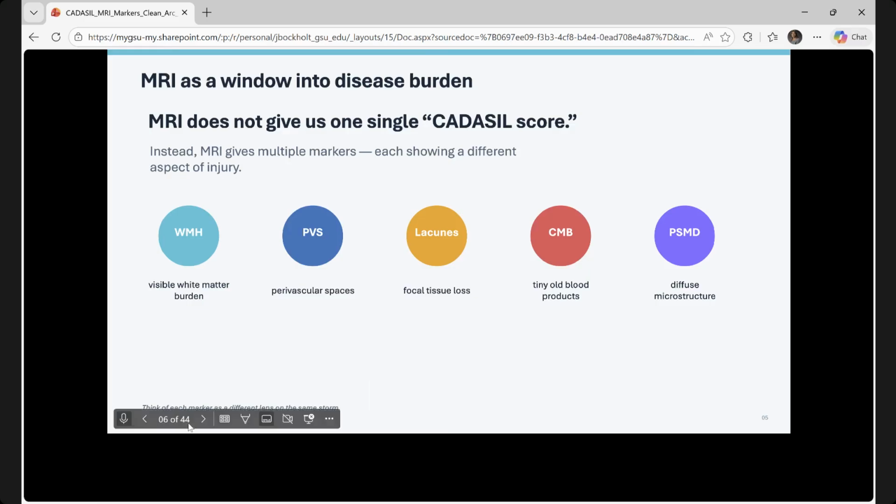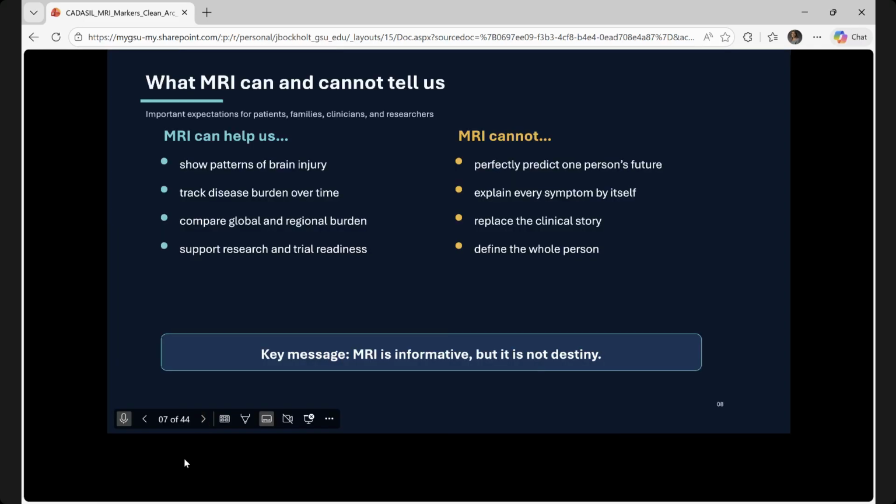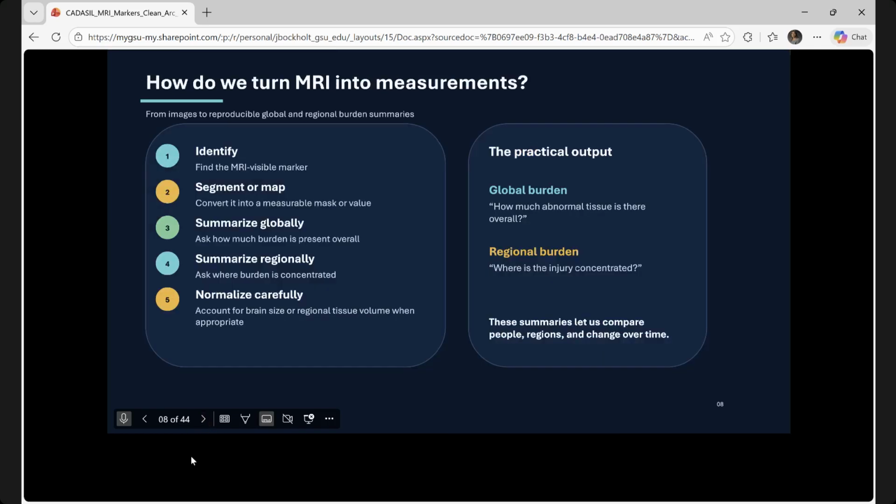How do we turn what we collect as MRI into measurements? That's my job. I help with the methods to do this. I help with finding other teams' ways of doing it and integrating, extending, or improving it, or building on our own tools for doing this.